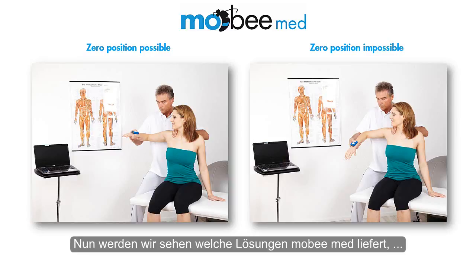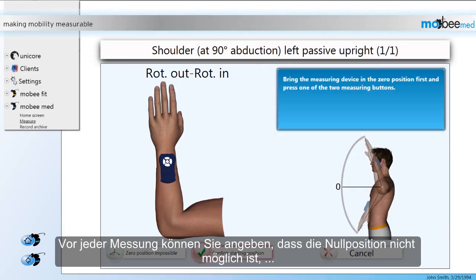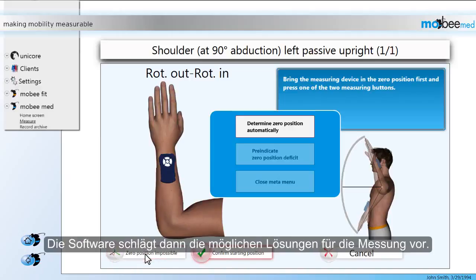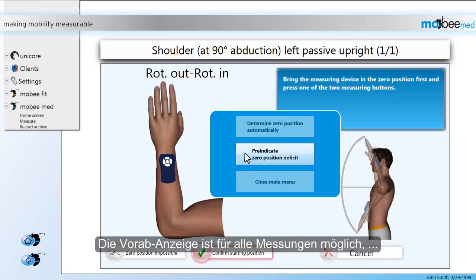Now we are going to take a look at which solutions MobiMead provides in order to document the starting position. Before every measurement you have the option to indicate that the zero position is impossible by clicking on the button Zero Position Impossible. Then the software offers the solutions available for the current measurement. You can either determine the zero position automatically or pre-indicate the zero position deficit. The pre-indication of the zero position deficit is available for all measurements, and that is why we are going to look at this solution first.